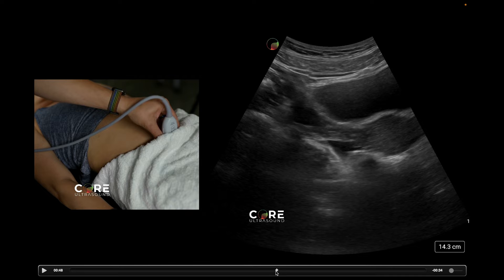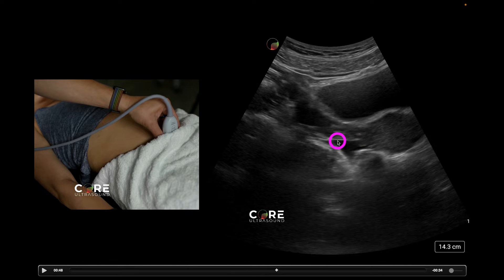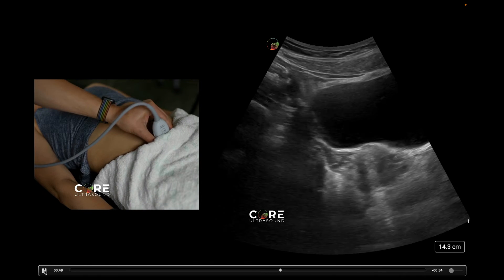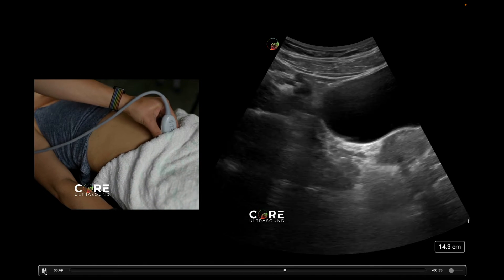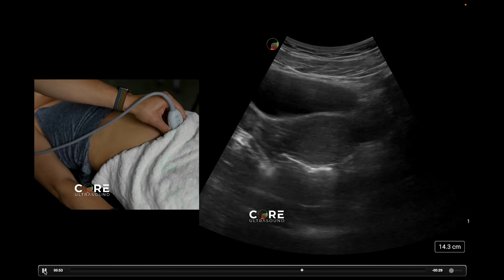I do want to comment on this right here. This is a small bit of pelvic free fluid. On this specific patient, who is completely asymptomatic, in the emergency department I likely would not worry about this too much, but do know that this is some pelvic free fluid. The phrase I'm much more comfortable with now is: clinically correlate when you see that.